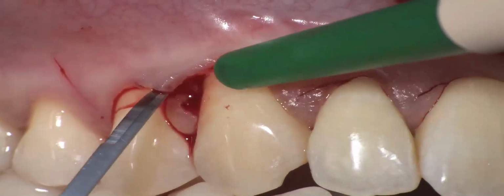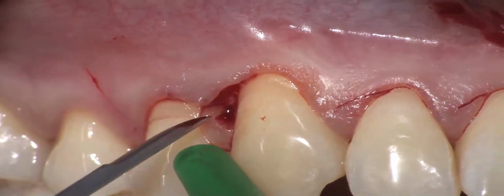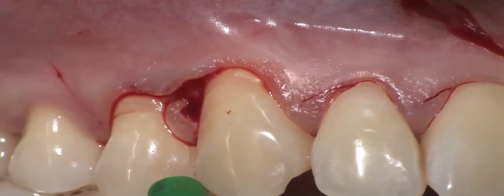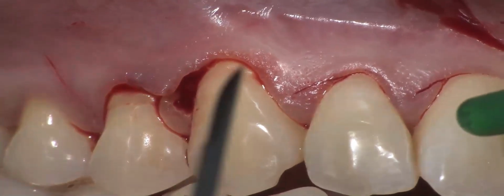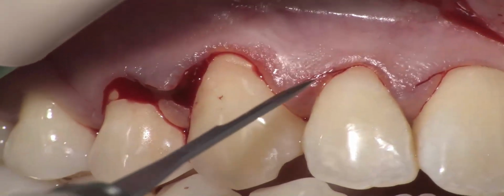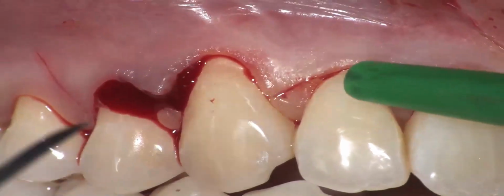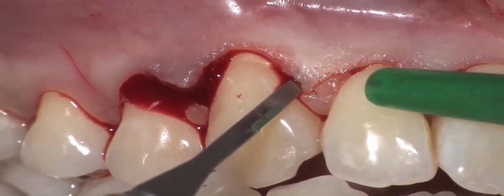So when we open this papilla, we are opening also the sulcus of both premolars. Right? Now we are doing the same thing on this surgical papilla. We design the tip of it.